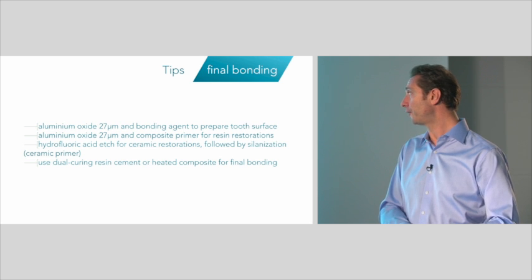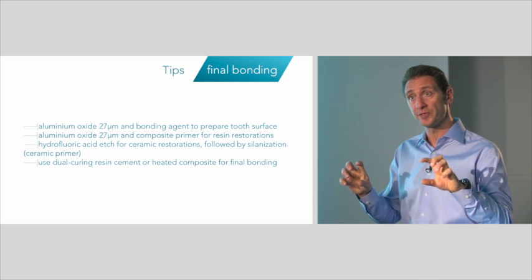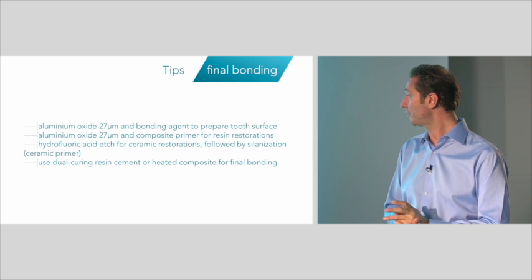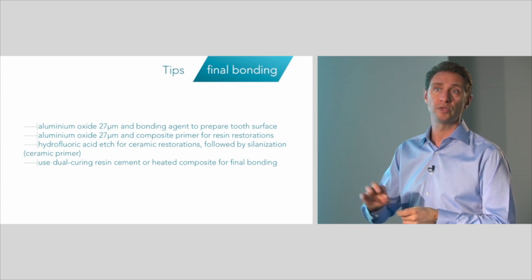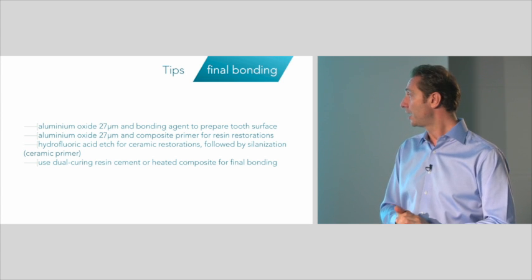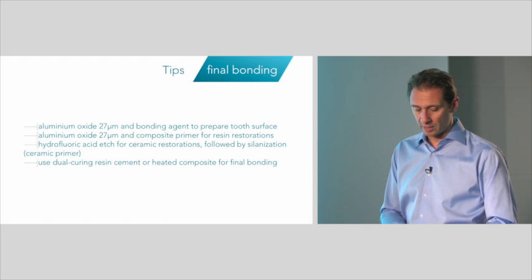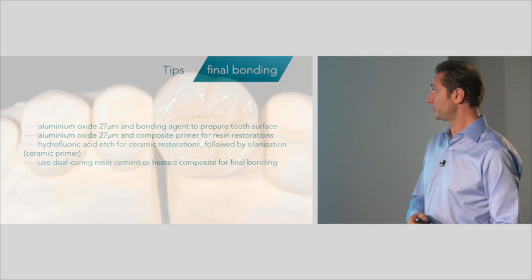The advantage of having 2 millimeter, evenly distributed thickness final restorations in the indirect is that you can have plenty of time to see to the restoration, to remove excess of composite and reduce the finishing procedure after bonding the final restoration into place.